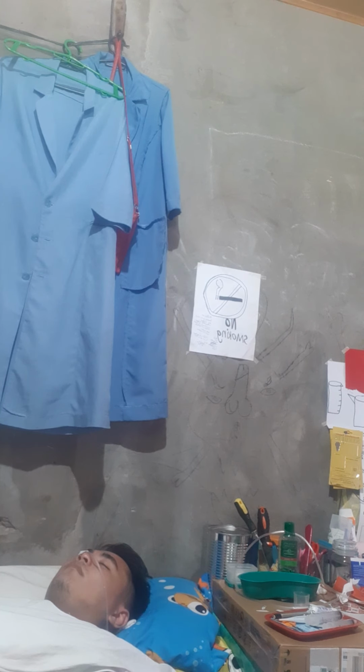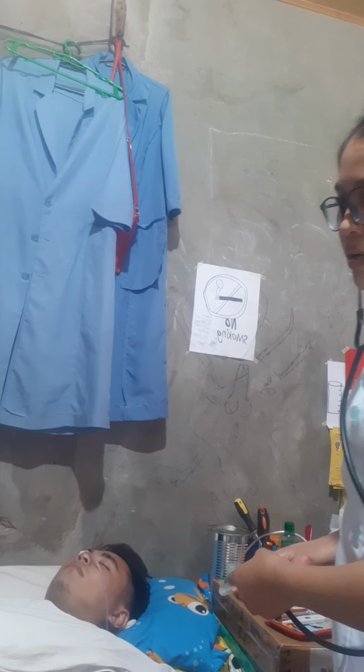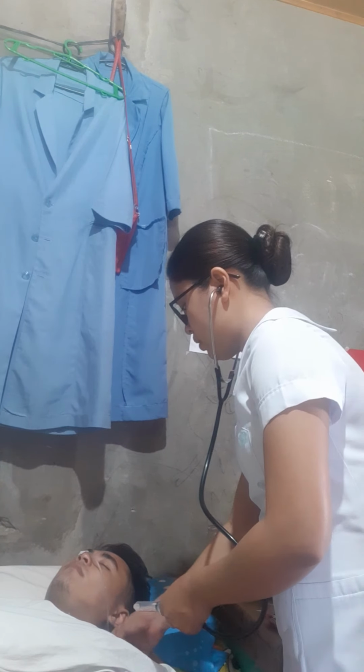Then next, we are going to place a stethoscope over the client's epigastrium and inject 10 to 30 ml of air while listening for the whooshing sound.